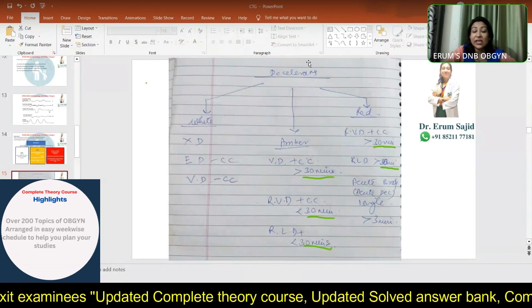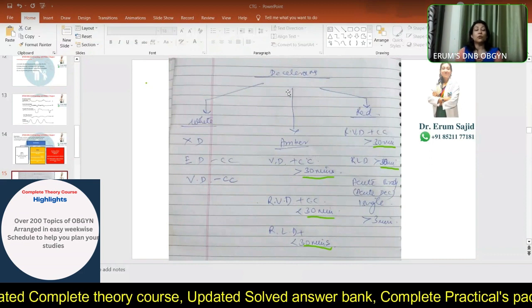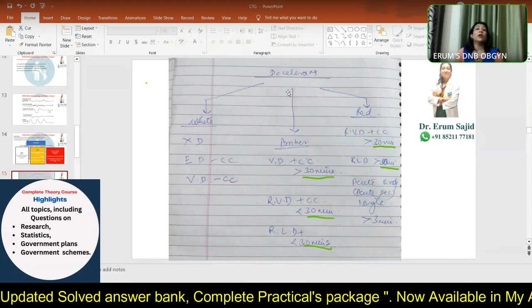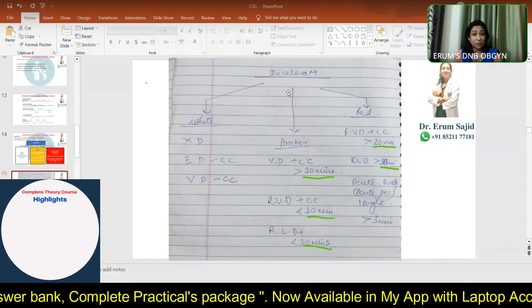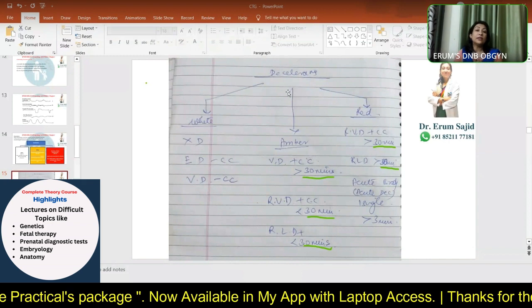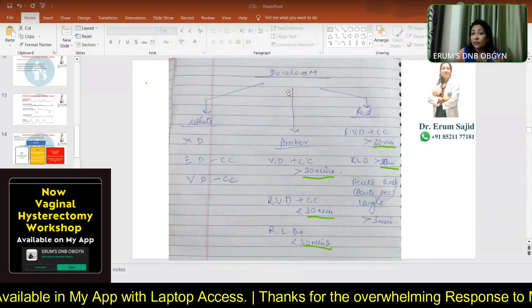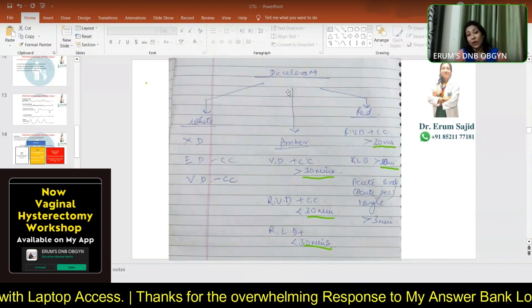So anyway, this slide tells you the 30-minute rule to understand the deceleration. I'll quickly revise it for you once again. Just imagine the white category for deceleration. If there are no decelerations, happy, you call it white. If there are early decelerations without any concerning characteristics, no matter what time frame, white. If there are variable decelerations, and I'm not saying repetitive variable decelerations, but without any concerning characteristics, label it as white.